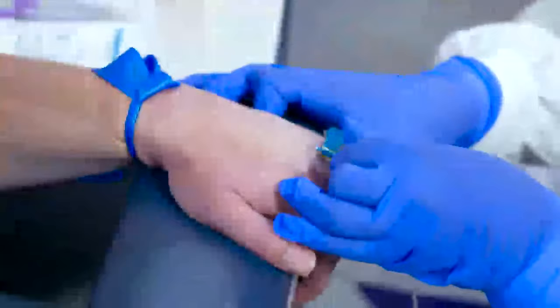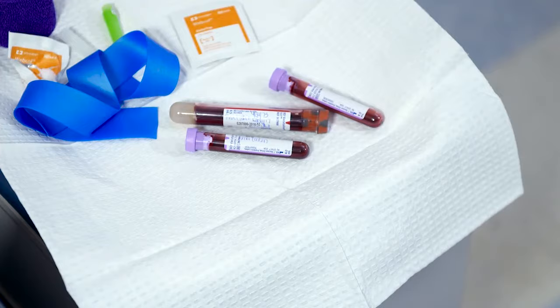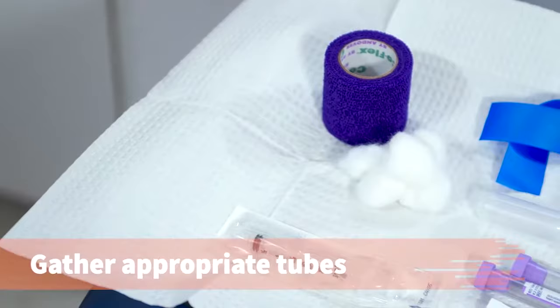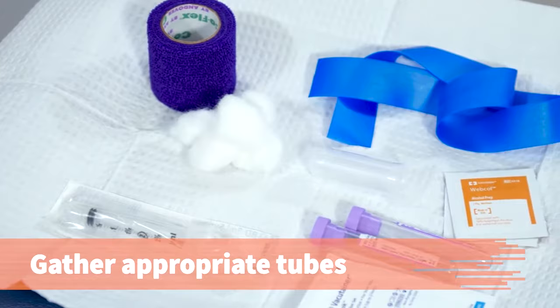In this procedure, you will learn how to obtain a venous sample from a hand using a butterfly needle with the vacuum tube method, or from an arm using a syringe method. Read the provider's order and clarify any questions with the provider. Gather the appropriate tubes, as specified on the requisition form, and all other required supplies.